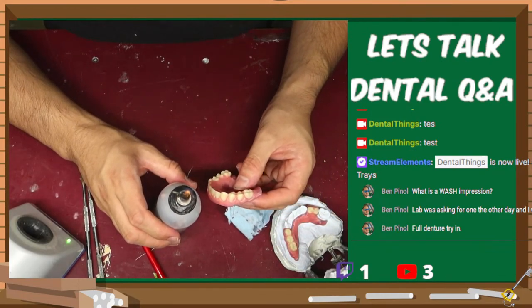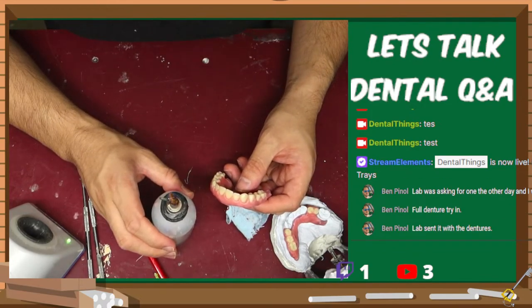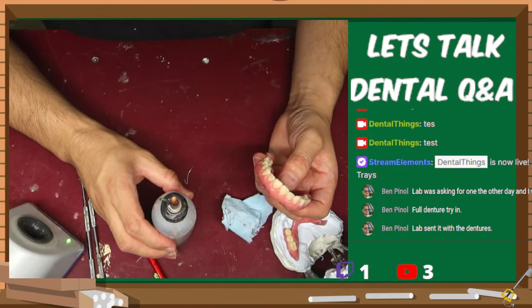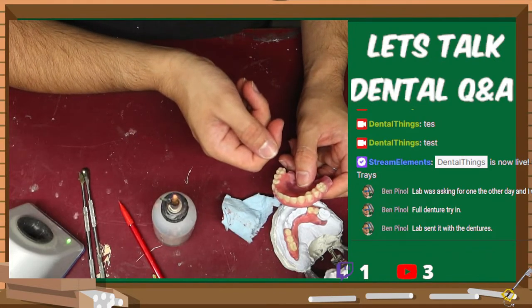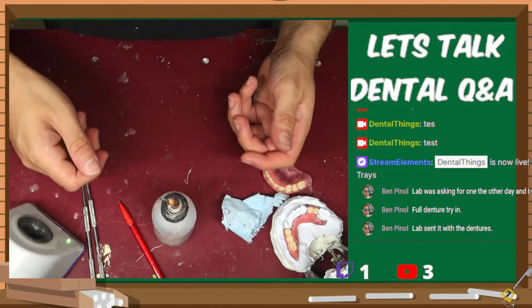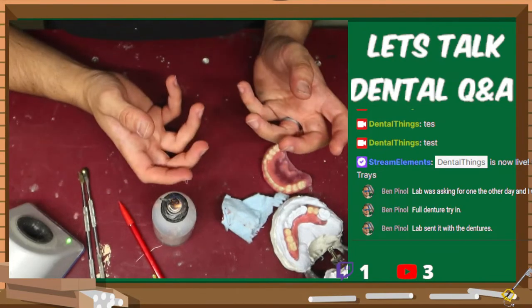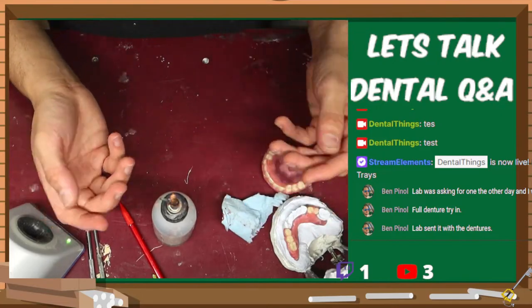Full denture try-in? I don't know what they were smoking then. A wash impression? Really? The lab sent it with the dentures. Are you sure they didn't want a custom tray? Maybe they sent a custom tray with you and they're saying, give us a wash impression. Because if they send you a custom tray, they just want you to put wash inside of it so you can catch details. When you take an impression with that custom tray, it's not that much material, but it's going to capture a lot of the stuff they want to see more detail on.